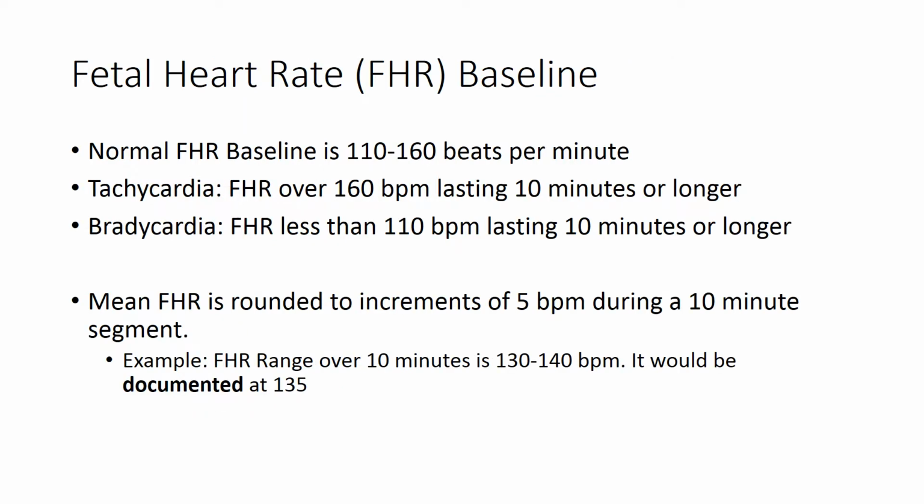Okay, so now I'd like to help you understand that the normal fetal heart rate baseline is between 110 and 160 beats per minute. Fetal tachycardia is defined as a fetal heart rate over 160 beats per minute, but it has to last longer than 10 minutes. Fetal bradycardia is a fetal heart rate less than 110 beats per minute lasting 10 minutes or longer.